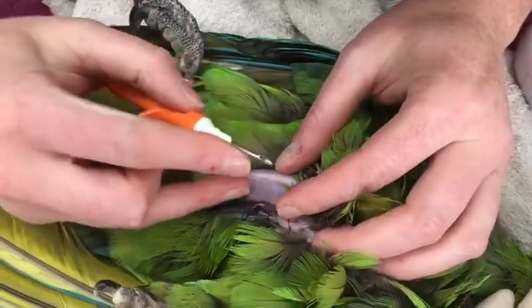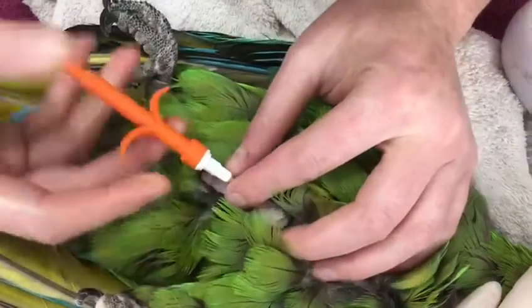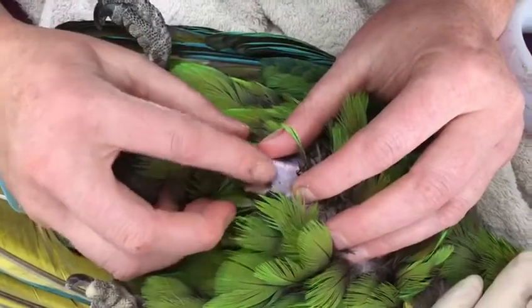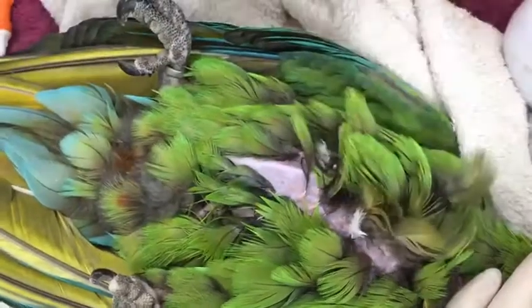You want to move the skin ever so slightly away from the site that it normally rests. Place the implant into the muscle like so. Pop a little bit of pressure there and allow the skin to fall back to where it normally sits, which allows the hole to be in a different site to where the microchip has been, which means there's less chance of it falling out.